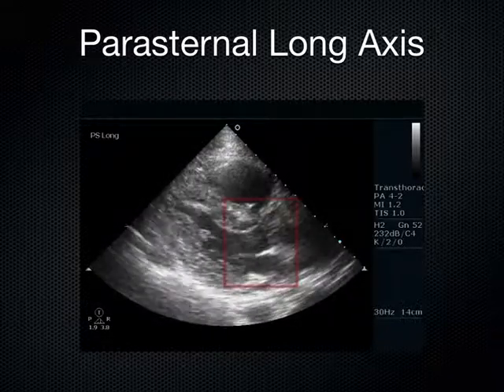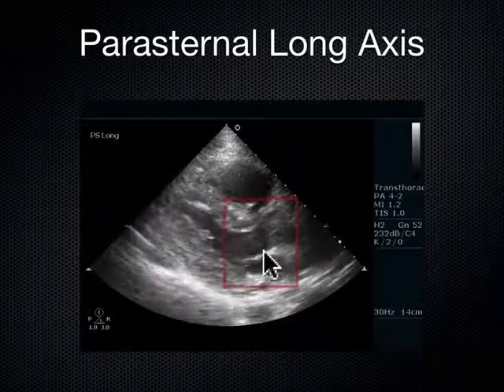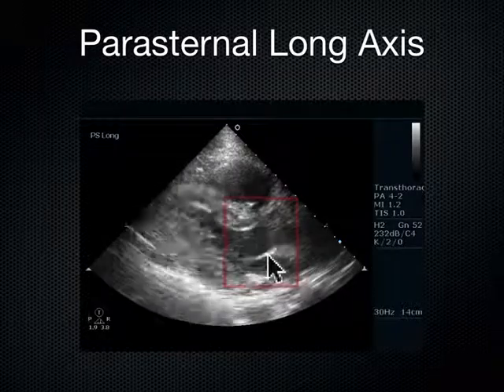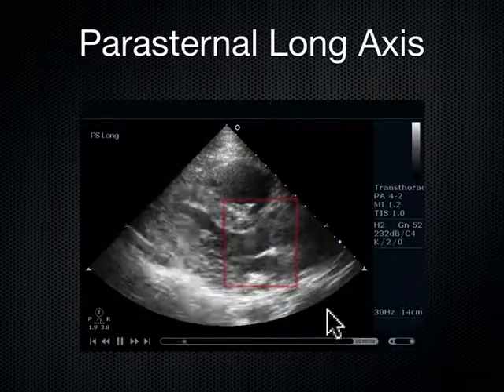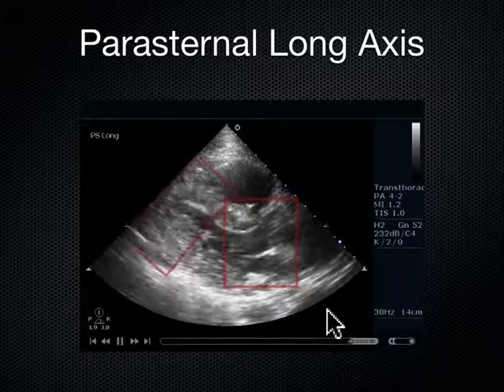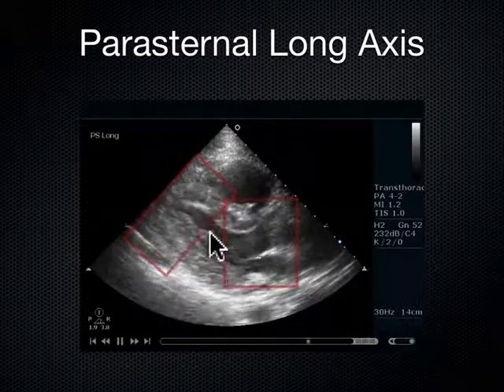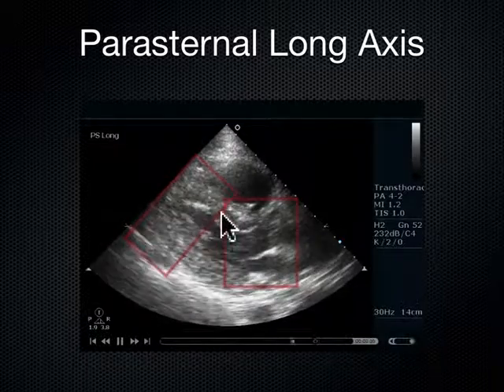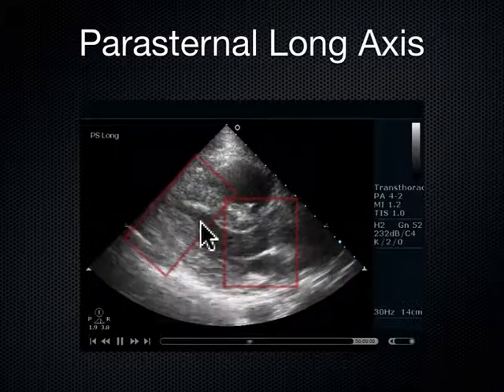So first of all, we've got that mitral valve. The mitral valve is just sort of camping out right here, not doing hardly anything at all. It's almost just fluttering along there, not really making any decent headway towards the septum. Then we look at the chamber size of the left ventricle here, and we see that interventricular septum and that posterior wall not really squeezing together very much. In fact, not really moving at all.